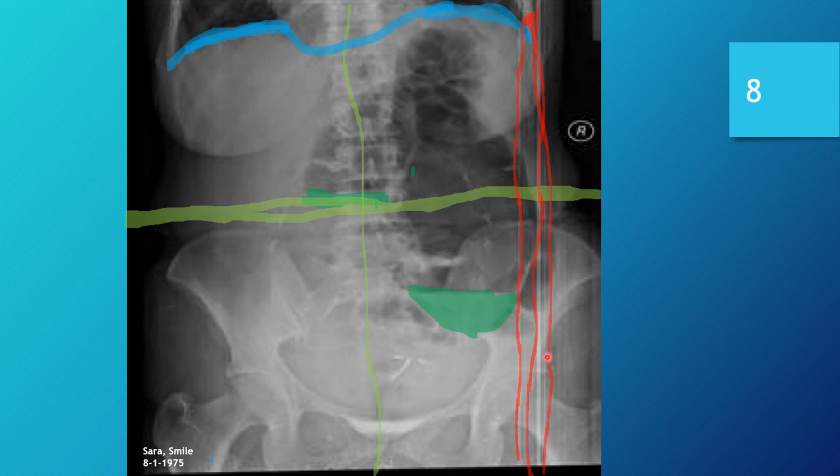So with these roller artifacts, in a scenario where these are present, you definitely need to have your equipment serviced. If it's not something you know how to do yourself, a cleaning procedure, whatever process is necessary to have that corrected, it definitely needs to be checked up on, because this is very detrimental to this image and is in and of itself warrants a repeat.